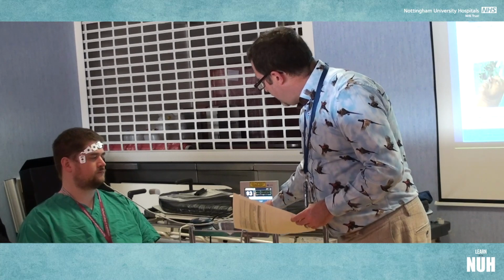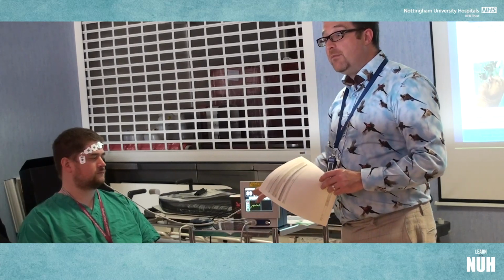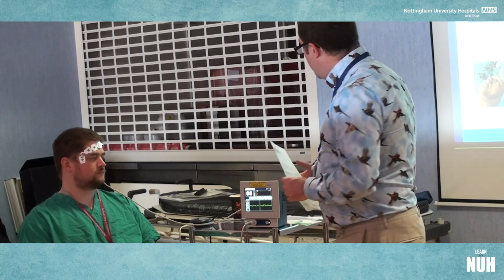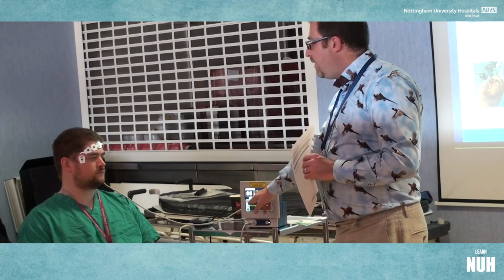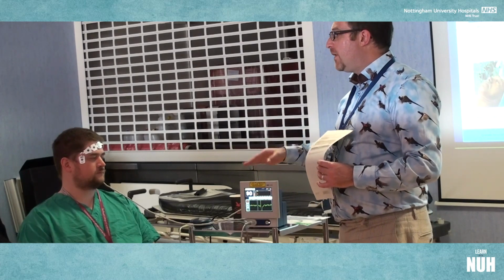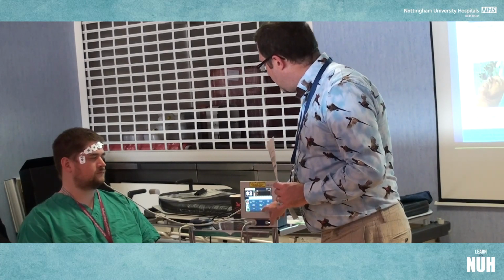So if we press the menu, we can press BIS and EEG and just change the two over. So if you want to read more technically the EEG, we can do that. Now, as I mentioned before, within the EEG, it's a digitized EEG, so we're looking at frequency and amplitude changes. But the more technical among you might want to look for delta waves or delta peaks interspersed with alpha, you know, if you're reading up on this and you want some more surety.